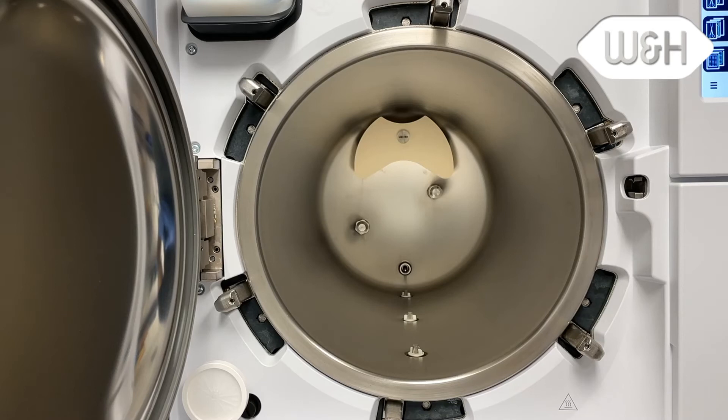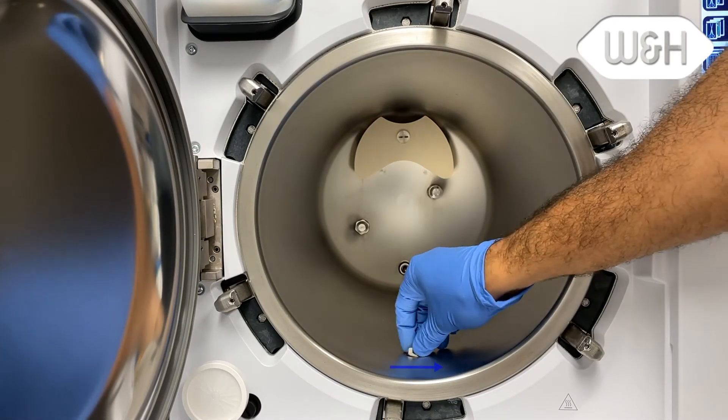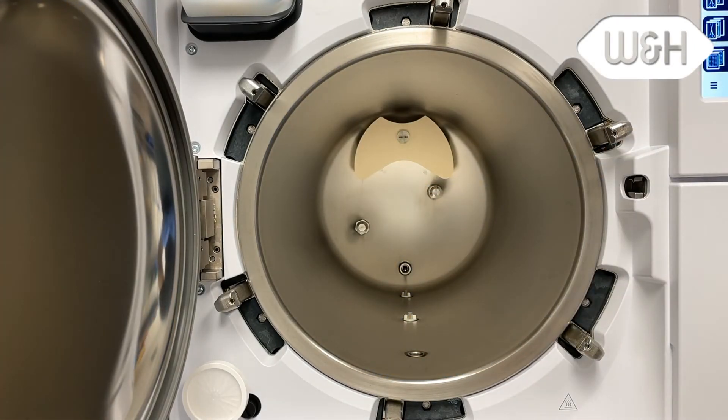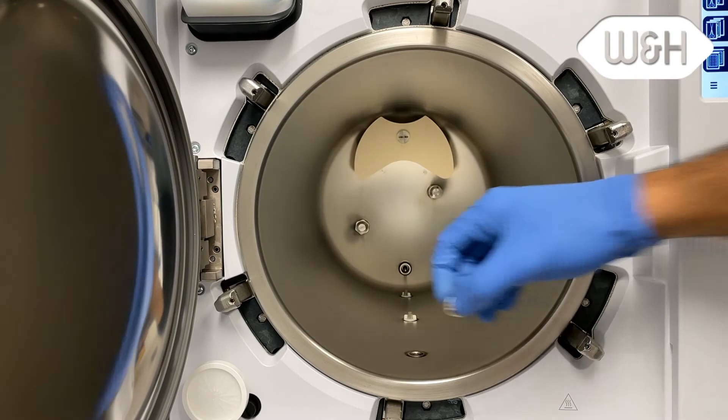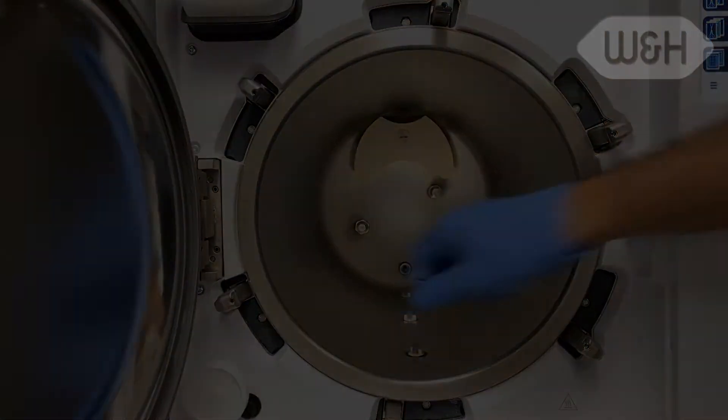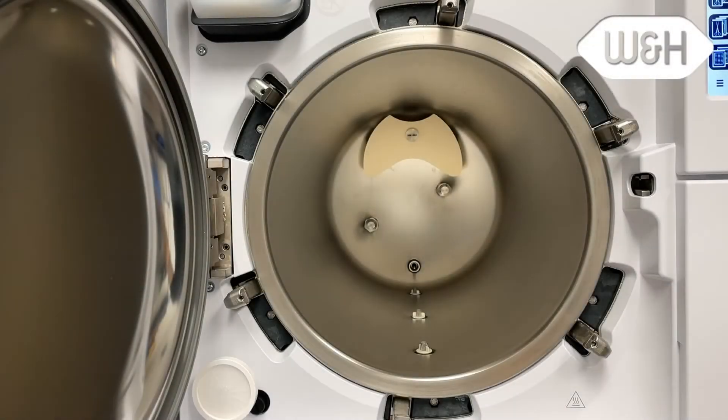Once you've cleaned the chamber, unscrew the three chamber filters by rotating counterclockwise. Rinse under clean tap water and then return the filters. Be careful not to damage the temperature probe located in the back of the Lexa chamber.